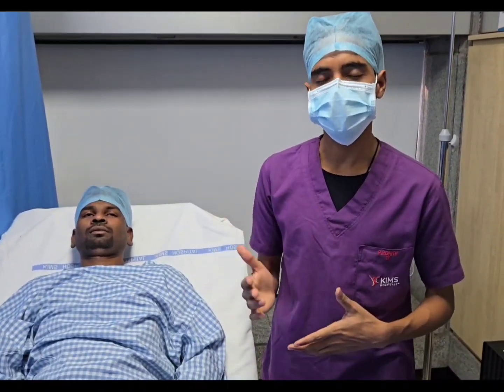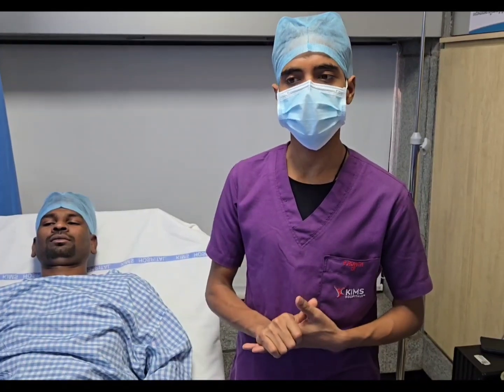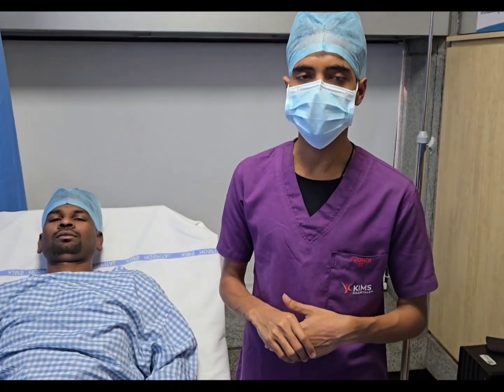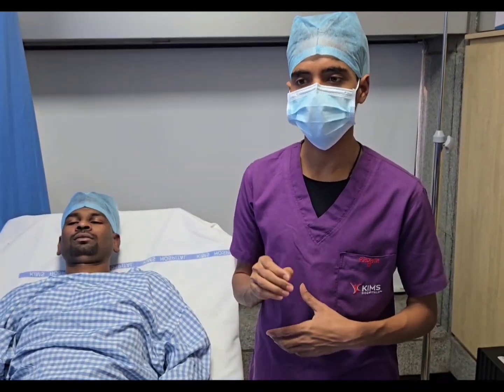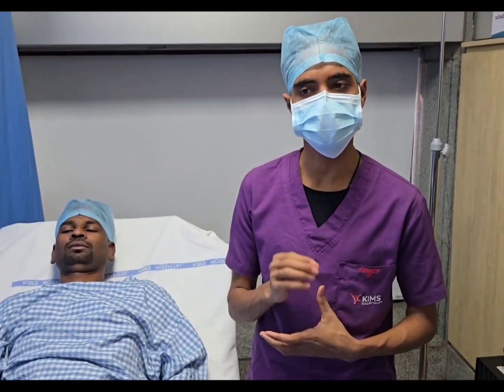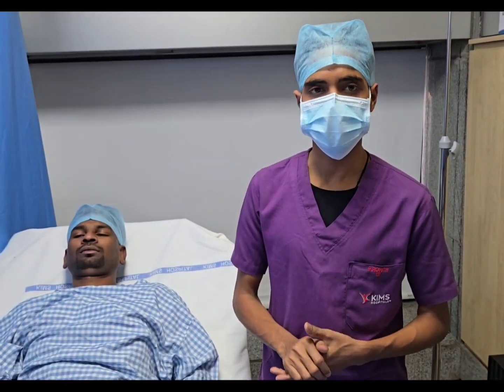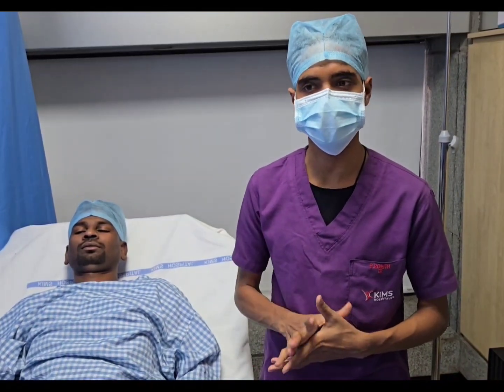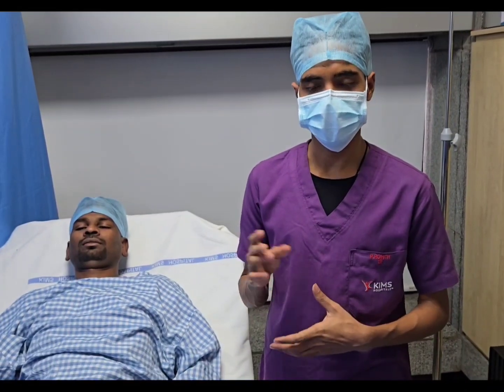What are the contraindications? In which patients should we not keep the oropharyngeal airway? For conscious and semi-conscious patients, we should not keep it. For patients with oral and facial trauma, presence of gag reflex, or a recent history of oral surgery, we should not keep the oropharyngeal airway.